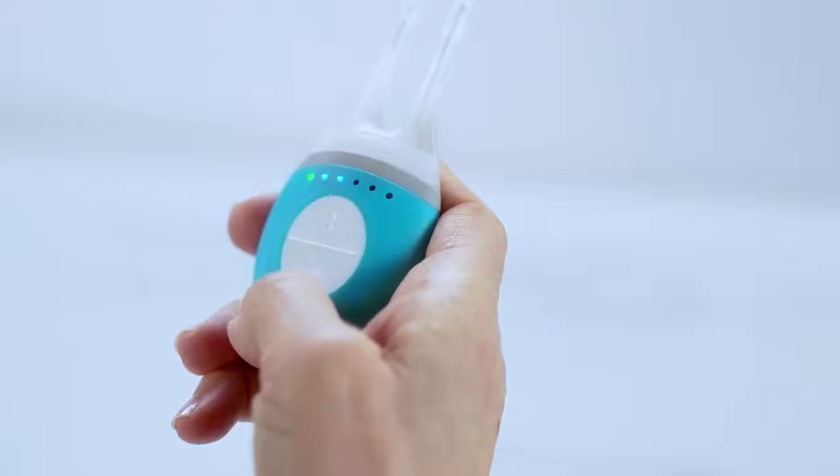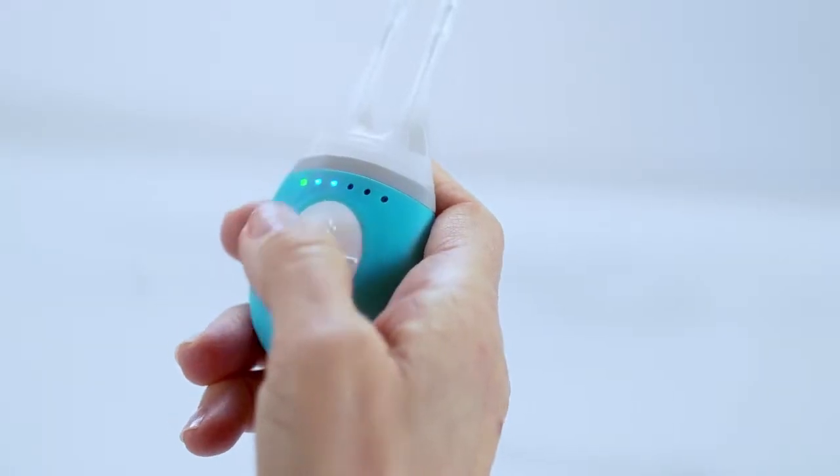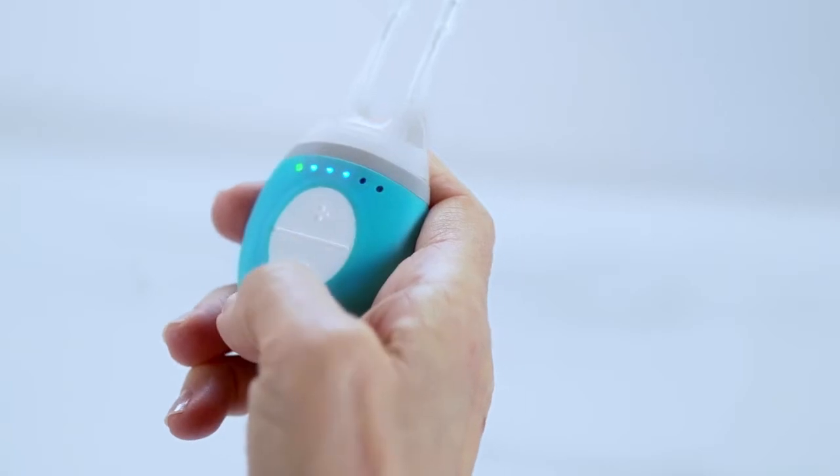If it's your first time using TrueTear, it may take a few tries to find the target tissue. If you don't experience a pulsing sensation, try increasing the strength one level at a time until you do feel it. It's common that some patients may sneeze or experience a sneezing sensation. Remove the tip from your nose at any time if you feel uncomfortable.